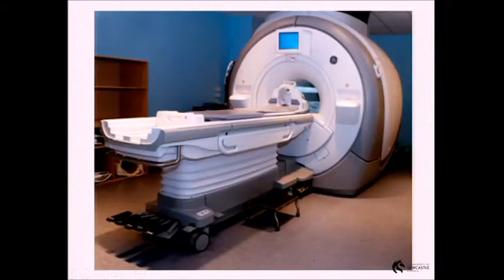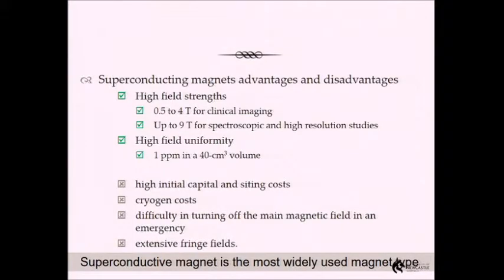So there's a typical image of a superconductor magnet. As I said, you can see the table, that's a detachable one. Patient lies up here and then is incrementally moved into the scanner. So that coil that's on there is one that's a combined head and neck coil. It's got a little mirror system on the top. So typically when you put someone in there to help them deal with their claustrophobia, you adjust the mirror, and it's a bit like a periscope. They can see out and maybe not be as claustrophobic.